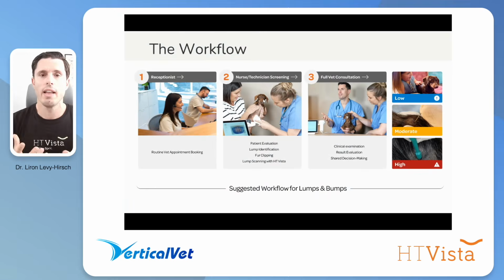And I have a short, very small slide to show the process that we have seen works in a veterinary practice. The technicians have a major part in the process. By allowing the technicians to take responsibility for the scanning process and perform the scan and get the results before the full vet consultation, the whole process of management of lumps and bumps becomes much more efficient, much easier for the pet owner and the vet team, and saves a lot of money for the pet owners that maybe initially, because of cost constraints, wouldn't want to do anything.